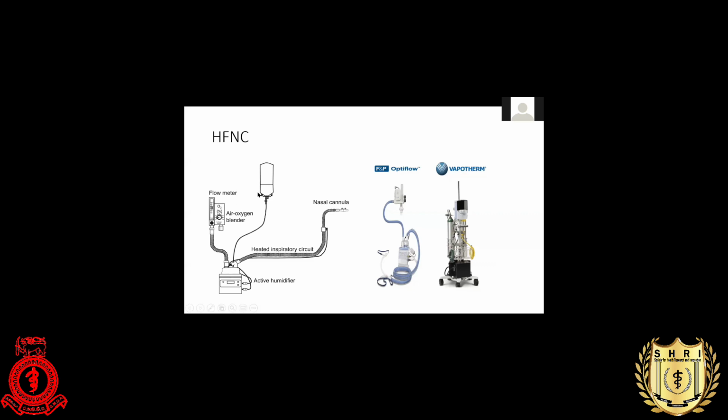And this bag contains sterile water. That will help to humidify the air, and don't use normal saline or distilled water or dextrose for this one, because they recommend using sterile water. And this is a nasal cannula we attach to the patient. This is a common machine available. This one is available in Sri Lanka.